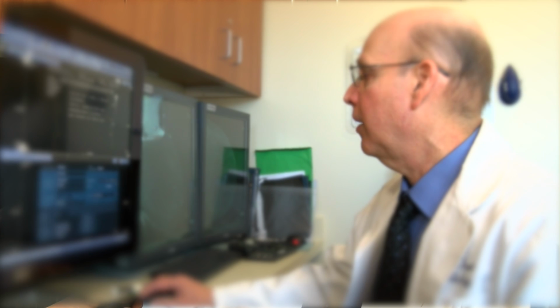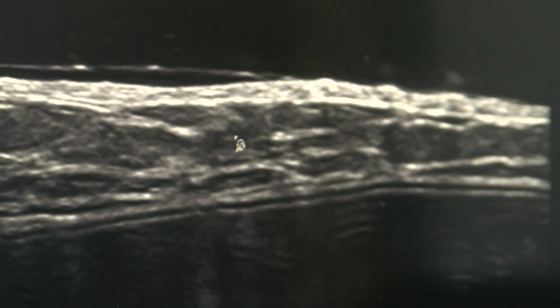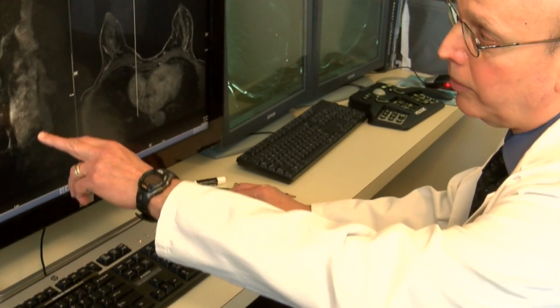And the recall rate is when a patient has a routine screening mammogram. She is a patient who has no symptoms. She comes for her mammogram, and she may receive a letter from us or a radiology facility that states that she has a questionable abnormal finding on that screening mammogram, and she has to return for a diagnostic mammogram and possibly an ultrasound examination. When we do the 3D technique, which is combined with the 2D technique at screening, it reduces that recall rate. It reduces the number of false positive examinations. It also eliminates the cost involved to the patient in coming for another mammogram and ultrasound, and also it has been shown to decrease the number of unnecessary breast biopsies that are done for benign findings.